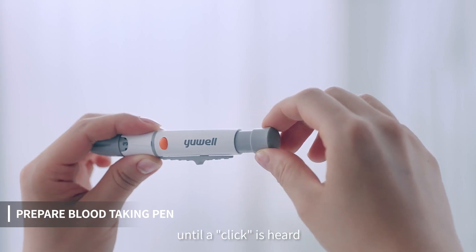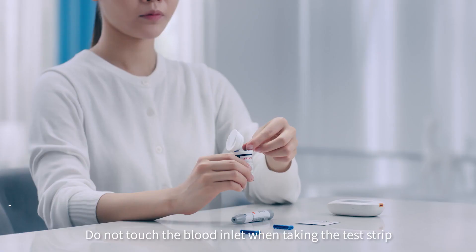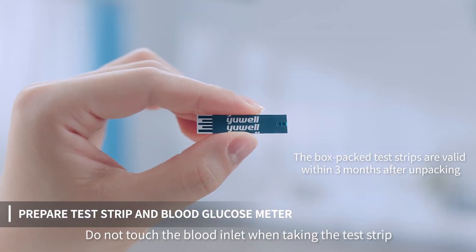Pull the handle backward until a click is heard. Do not touch the blood inlet when taking the test strip.